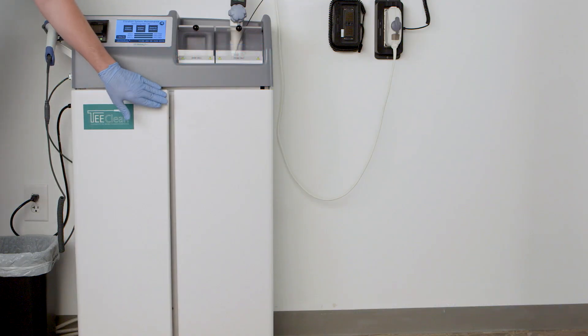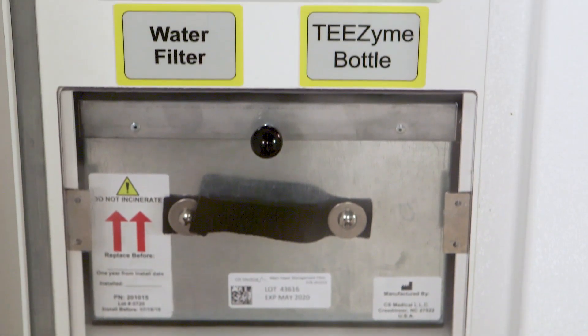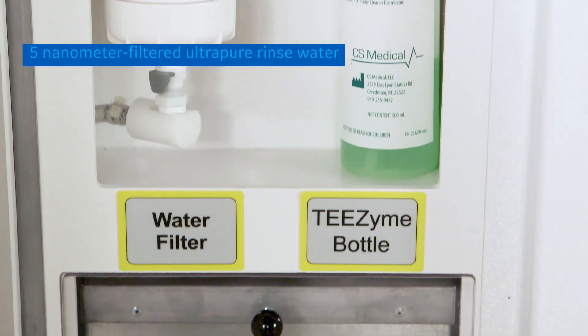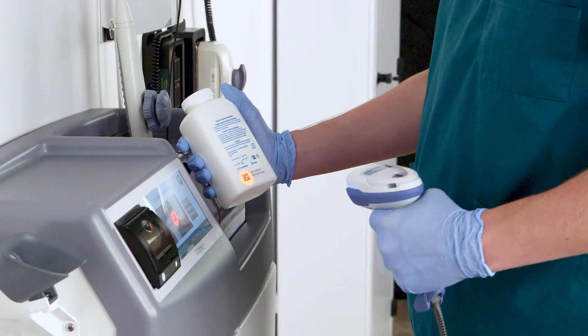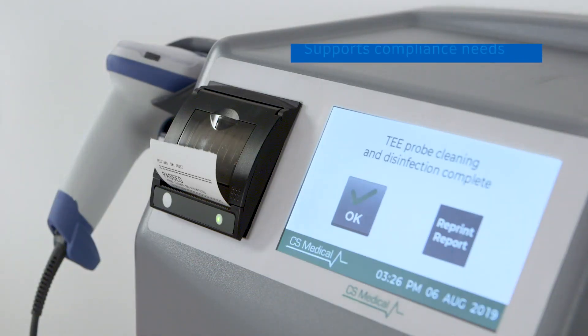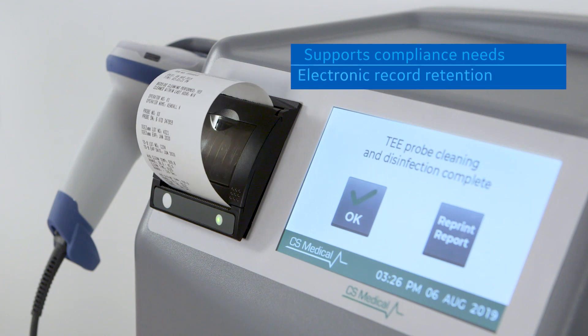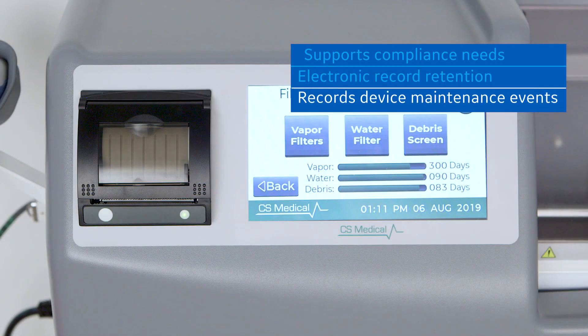Waterborne bacteria are becoming an ever-growing challenge in healthcare facilities. The integrated water filter can deliver five nanometer filtered ultra-pure rinse water to the T-Clean. During the entire cycle, time and temperature are monitored. To support compliance needs, T-Clean provides electronic record retention of the clean and disinfection cycles, and also records device maintenance events.